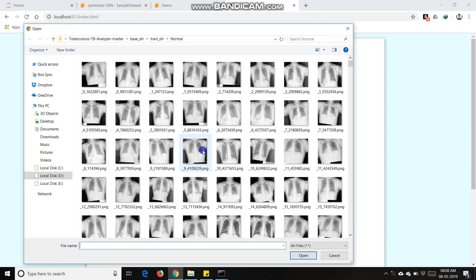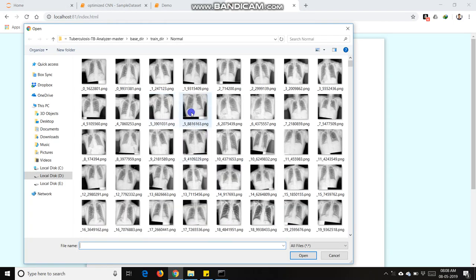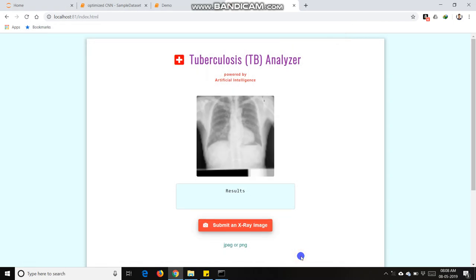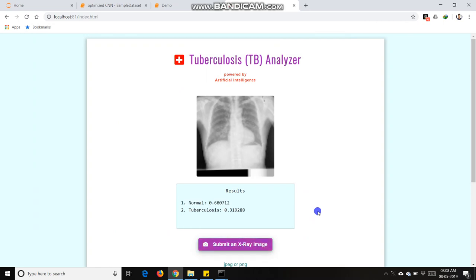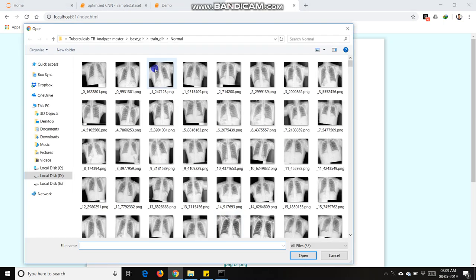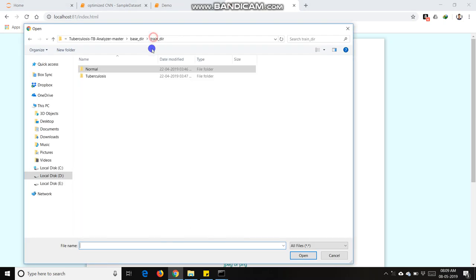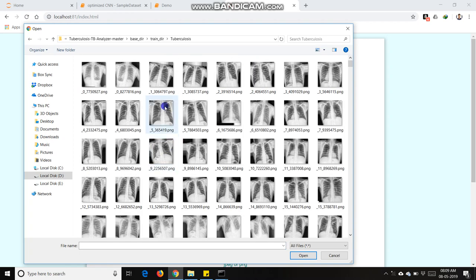Now I am going to upload an X-ray image. It predicts that 68% X-ray image is normal and 31% is TB infected, so finally we conclude that it is normal person image. I am taking another image, TB infected person.